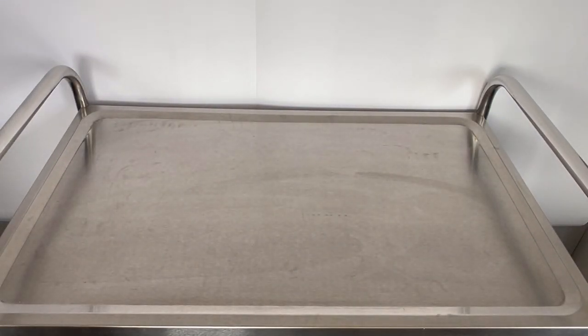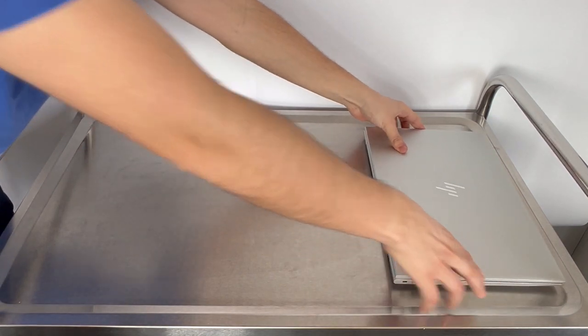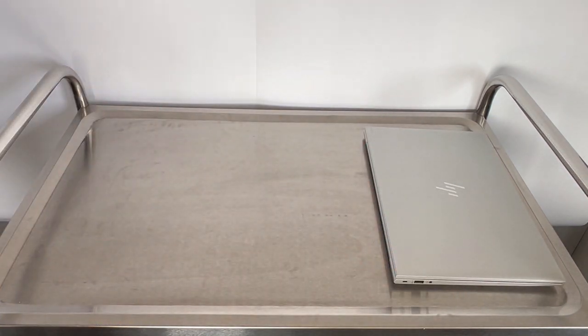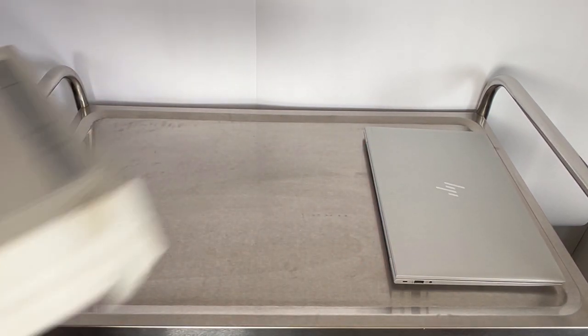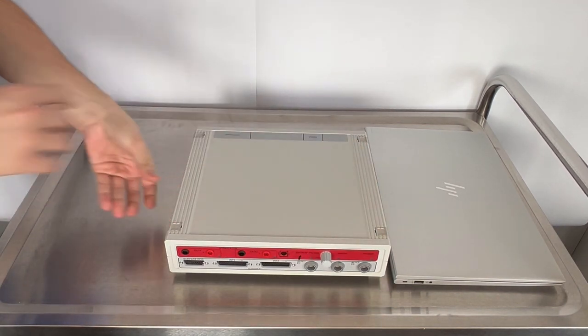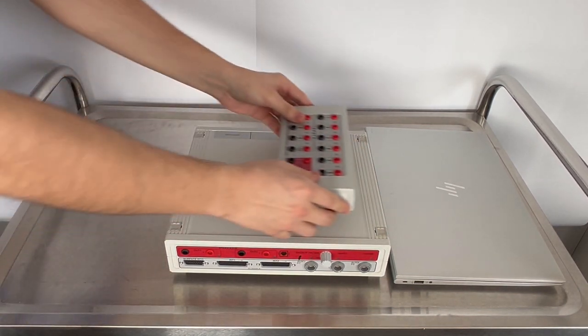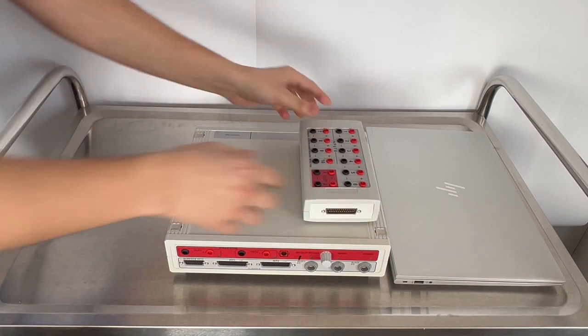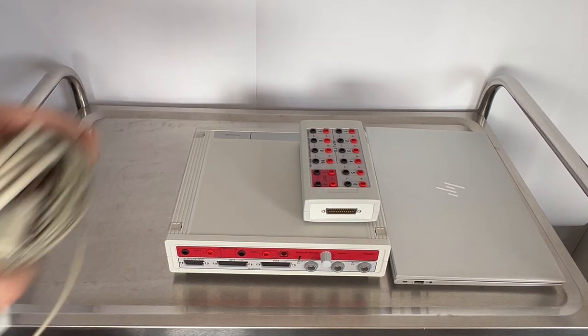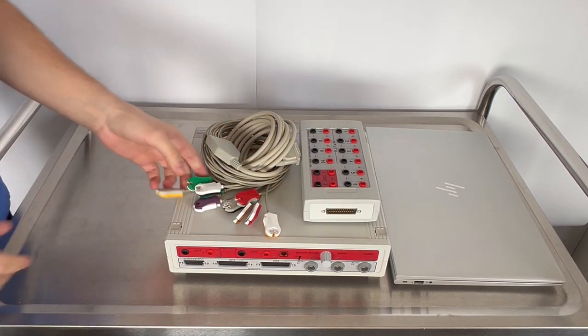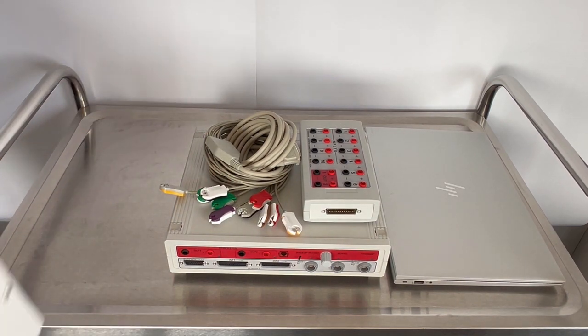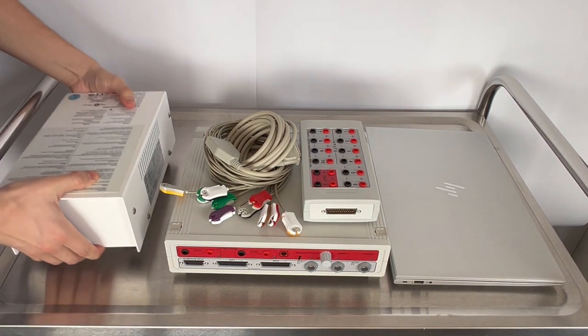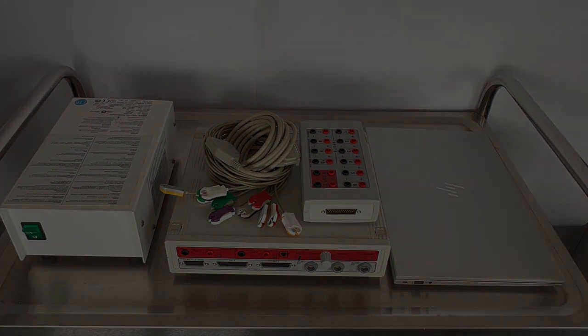This cutting-edge system comprises a standard laptop, an amplifier, connection boxes and ECG cable designed to seamlessly capture and process cardiac signals. All connected to a transformer to ensure electrical safety.